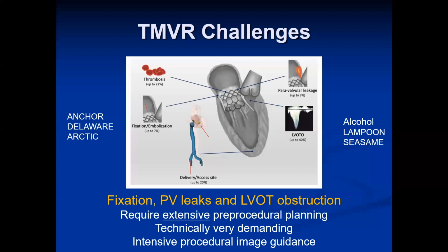So again, it's the opposite issue that now in the trials, if you look at the mitral transcatheter therapies, they're selecting the very best patients. They can have this or that, the other thing. Those are the ideal patients for the therapy, right? So they hopefully would have a very low incidence of paraprocedural complications. What's disappointing is, like the CLIP data, that even though you have great hemodynamics, such a large percentage of patients still die. I assume that that's from the underlying pathology or that we're treating very late.